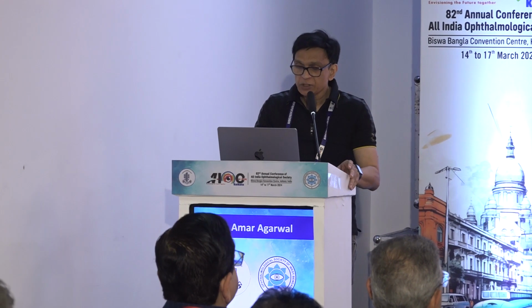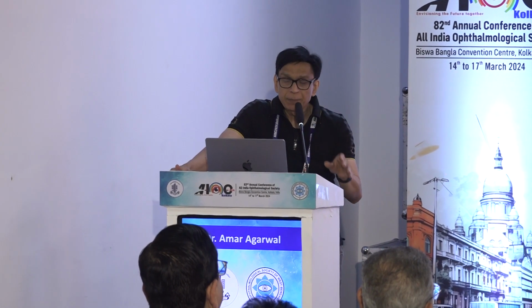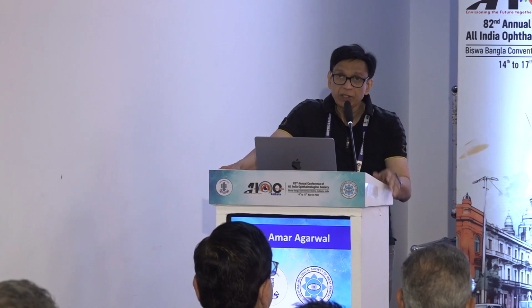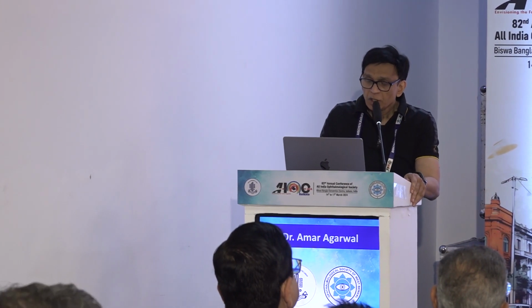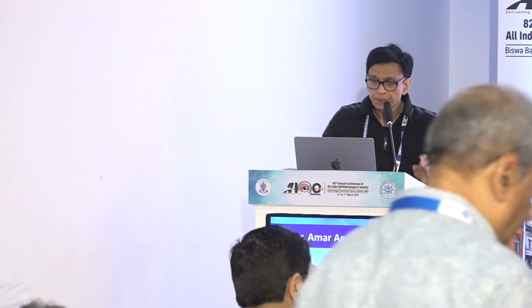So let's look at this case, okay? Toric multifocal IOL. This was a VIP patient. Obviously, the patient had LASIK done before, went in for a toric multifocal IOL, and ended up with a refractive surprise. The surgeon then called me up and said, I'm having a problem, what do I do? Now understand, these patients are very fussy. Obviously, they want to be without glasses.